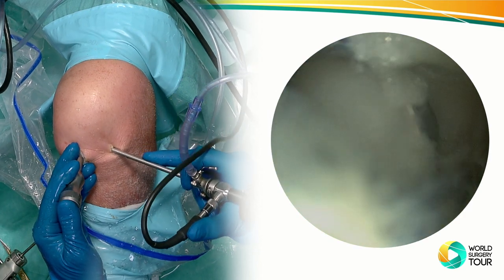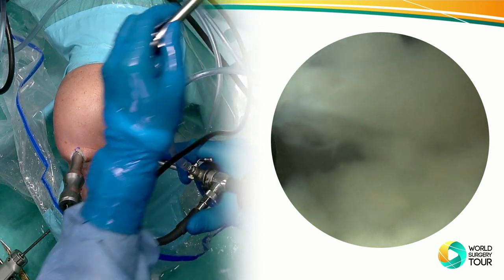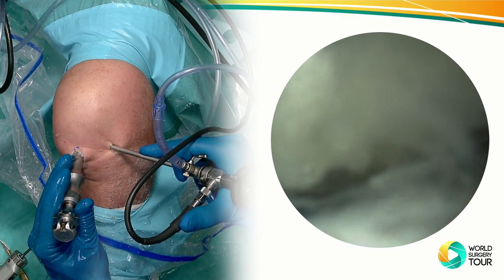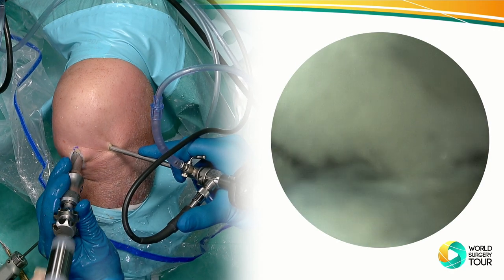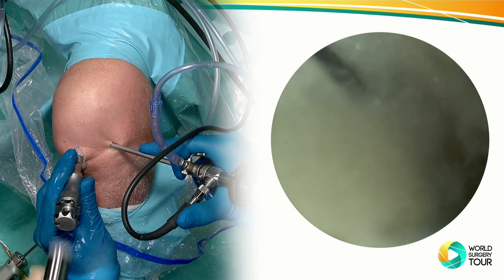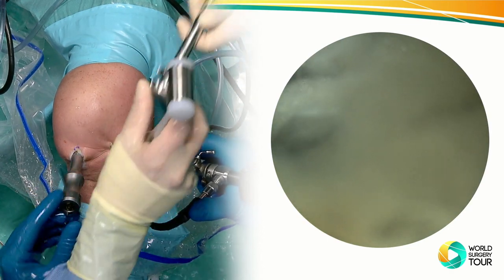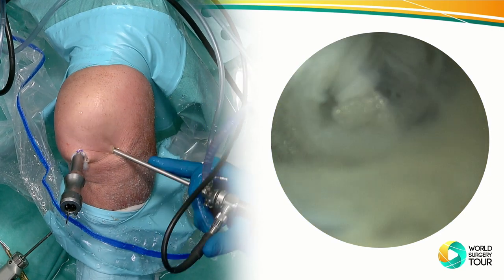That looks pretty decent. Now we're going to put in what's called a centralizer. It's going to make sure that the cannula stays in place, so we can easily remove the instrument and insert the instrument without losing the position. Okay, that's good, and you can turn it out. This wire is pre-bended, so it holds pretty well in the instrument. Let's see that we can see a little bit more.